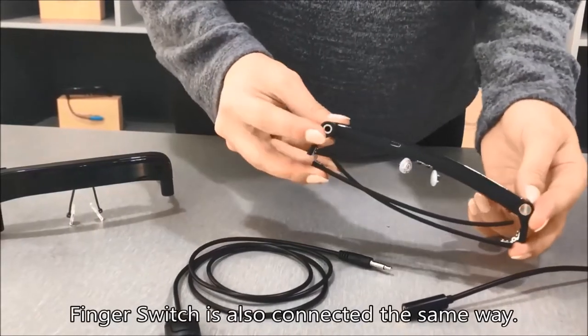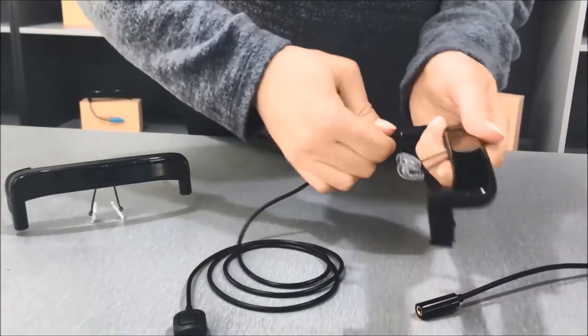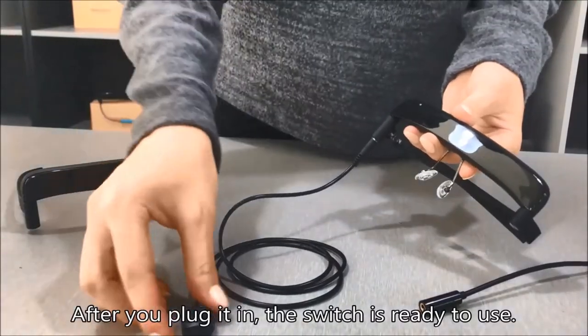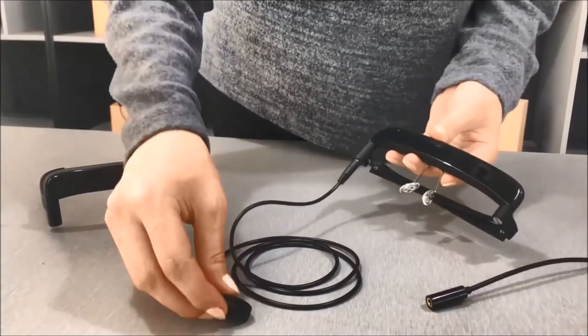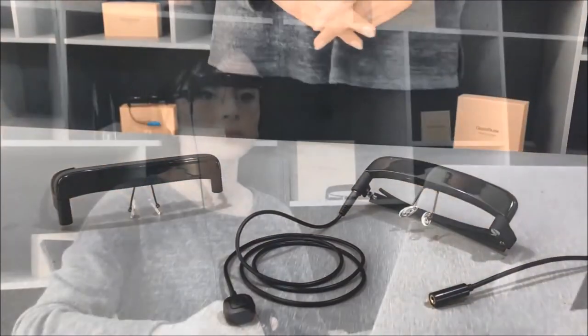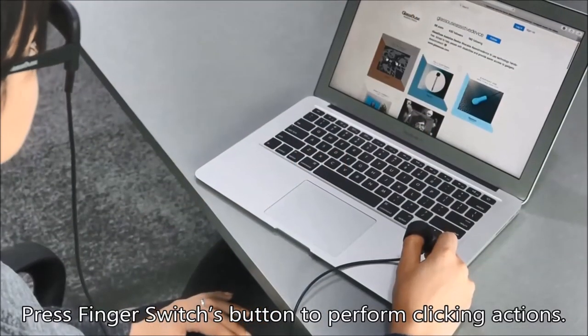The finger switch is also connected the same way. After you plug it in, the switch is ready to use. Press the finger switch button to perform clicking actions.